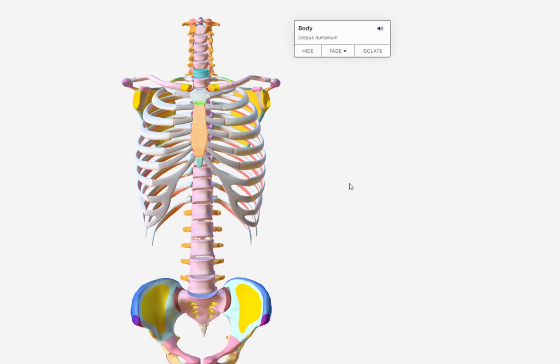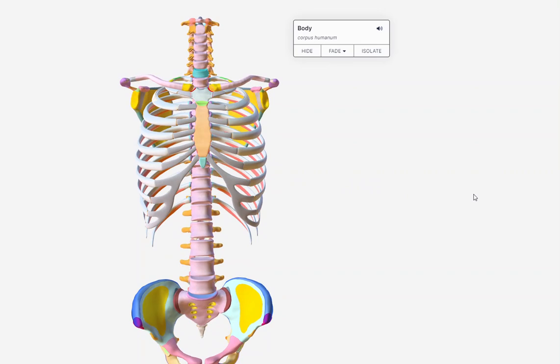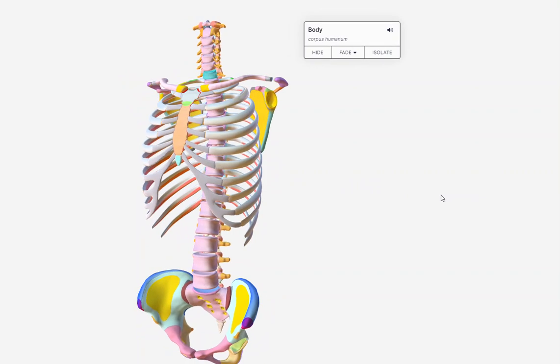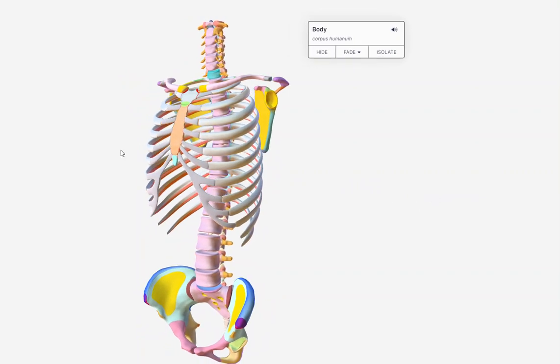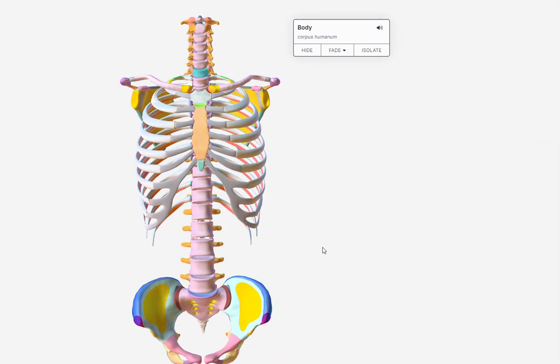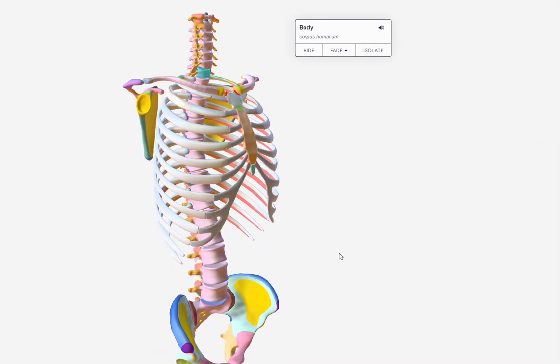Put them back, AP projection. We're going to put them into an RPO, rotating the right shoulder toward the Bucky or the IR table, however you want to think about it. The posterior right side is touching the Bucky. That is an RPO, right posterior oblique. The left shoulder is rotating up away from the IR or Bucky. Right, so I hope this was helpful in learning the obliques.